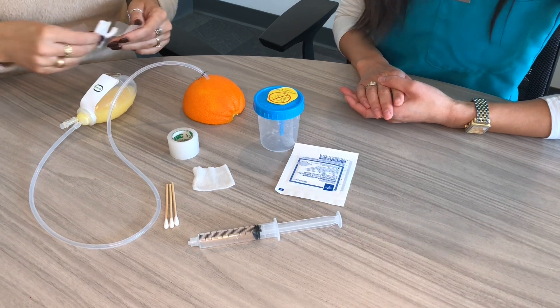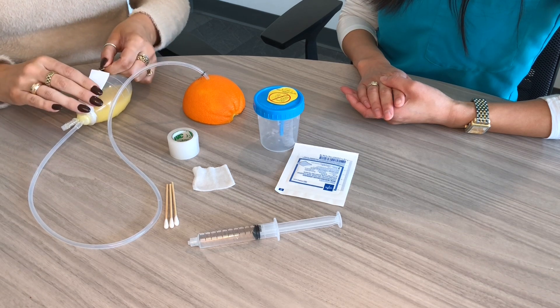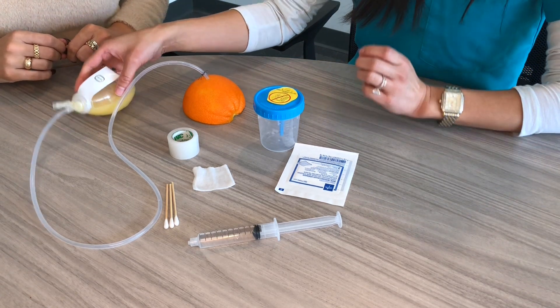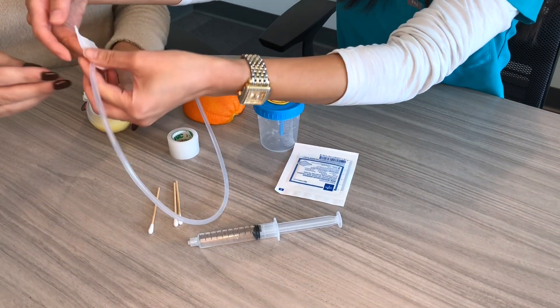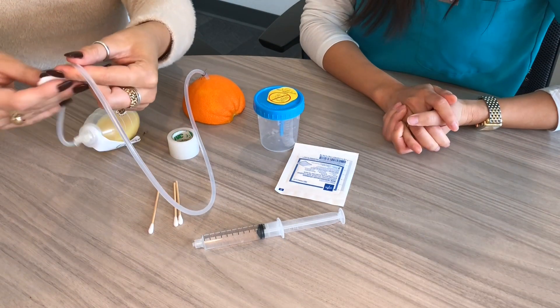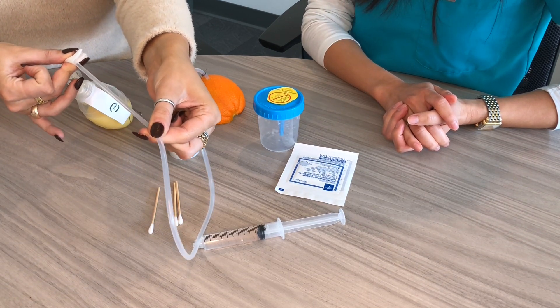Now you can unpin the drain from your clothing. If your team has told you to strip the drain, you can do that by squeezing the drain with an alcohol swab right here. You're going to squeeze and pull towards the bulb — just like that. Go ahead and pull towards the bulb before you empty it.